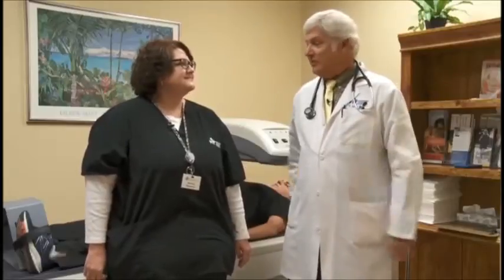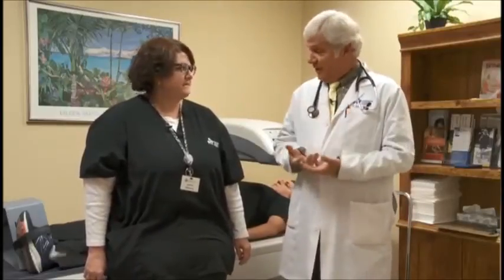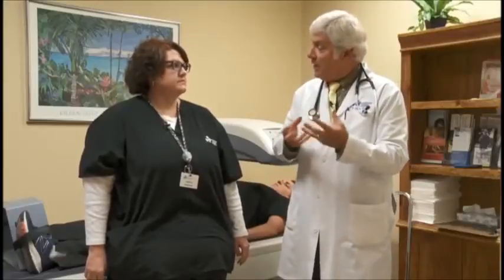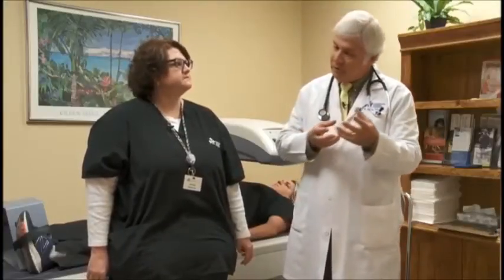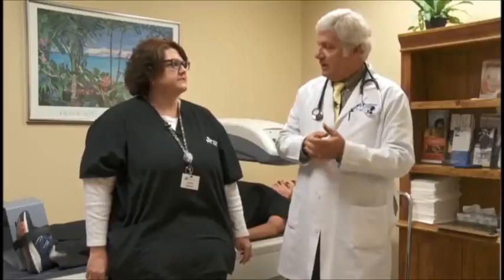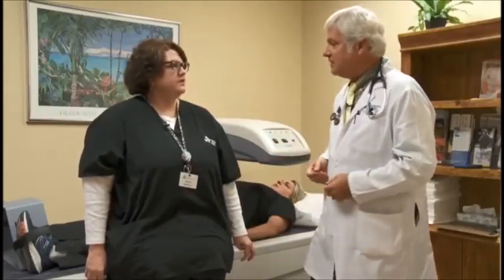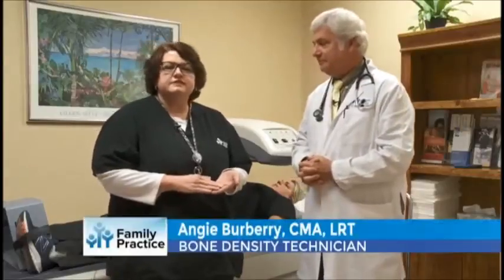So bone density, we're looking for screening for osteoporosis. And osteoporosis is looking for weak or brittle bones, which is different than arthritis in terms of joint pain. Yes, sir. So we're looking to see how strong the bones are. So take us through a bone density test. Tell us what happens. First thing we do is I do a little assessment of the patient.